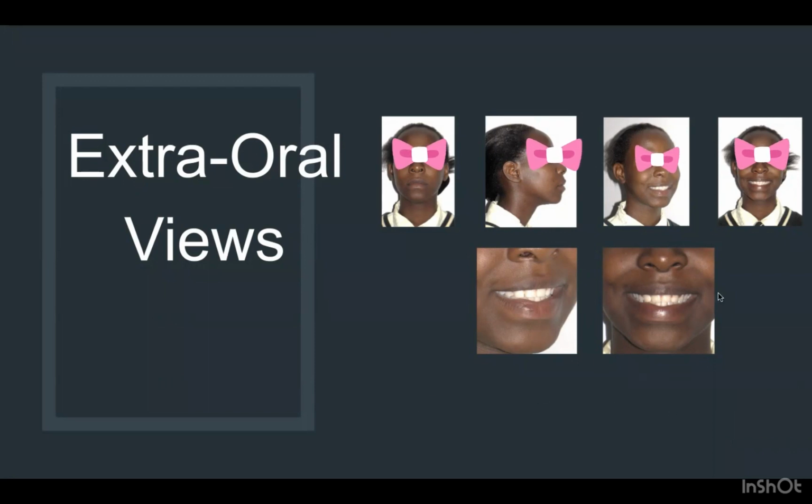Two are the smile close-up. One is a straight smile close-up. The third one is a 3/4 smile close-up. And how you get four of these pictures: here the patient is looking straight into the camera at their Frankfurt horizontal. Then here the patient's neck should not be overextended, should be straight, looking straight, and no smile. Then you take two smiling pictures, ask the patient to smile in 3/4 and ask the patient to smile while looking at you, okay?